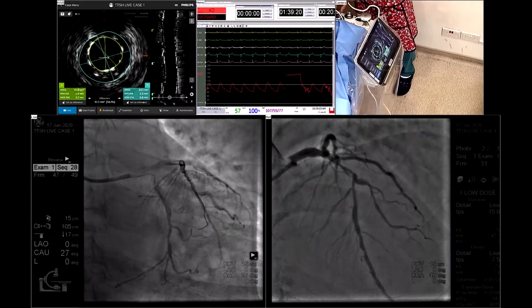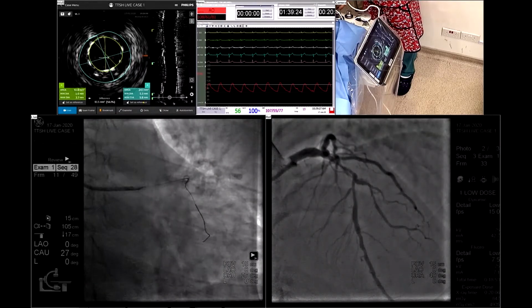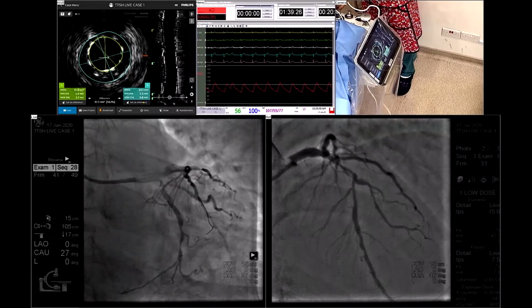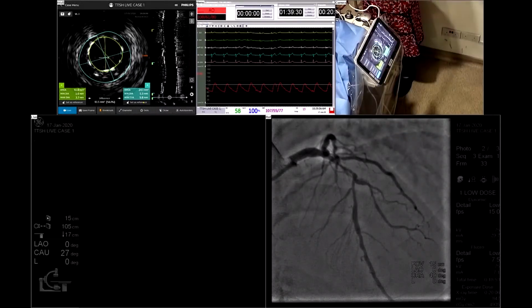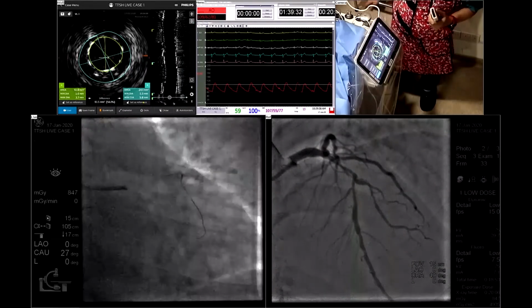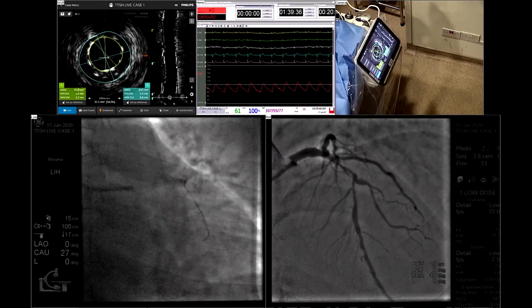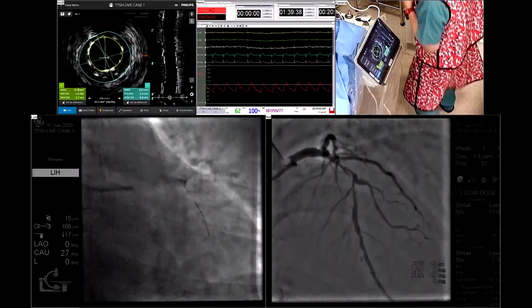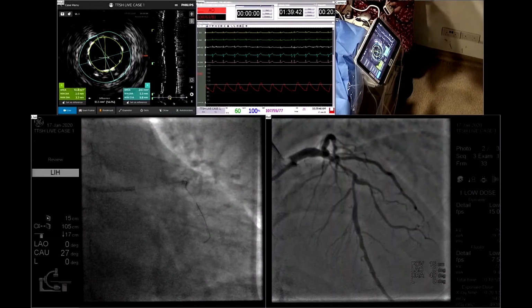How about you, Habang? Will you post-dilate with a 4? No, leave it alone. It's good enough. Okay, will you post-dilate, or will you leave it alone? If you look at the initial IVUS, the proximal reference diameter was 4. So I would gently go on just a nominal pressure, with a very short NC balloon, I suppose. Especially looking at the ostial LAD, I want a good result there.